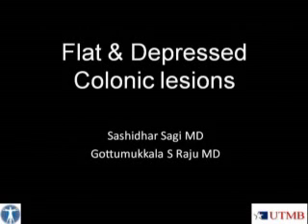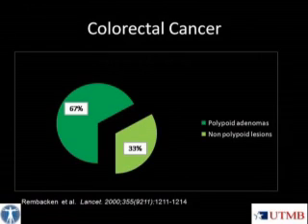In this presentation, we discuss the importance of flat and depressed colonic lesions and illustrate both types of lesions with endoscopic videos. A majority of colorectal carcinomas arise from polypoid adenomas. Up to a third of colorectal carcinomas may be arising from non-polypoid lesions, also known as flat and depressed lesions.